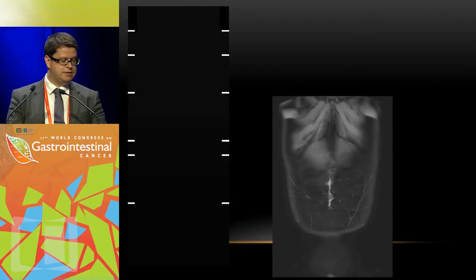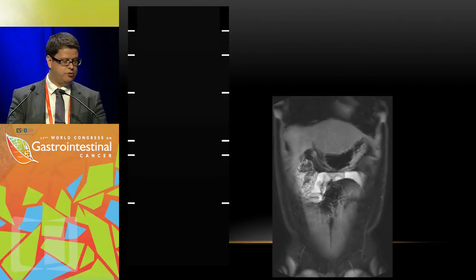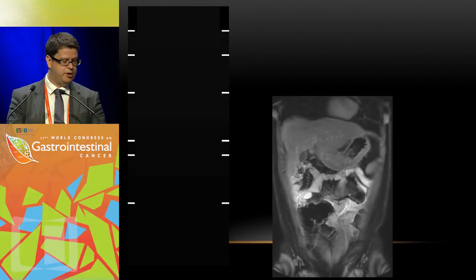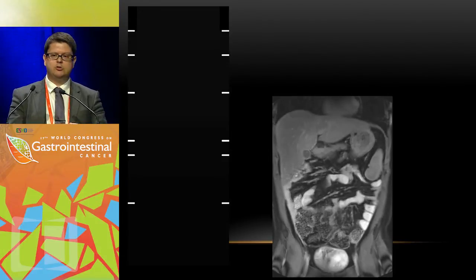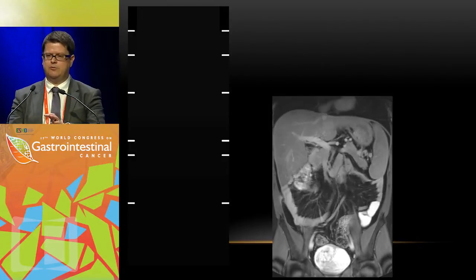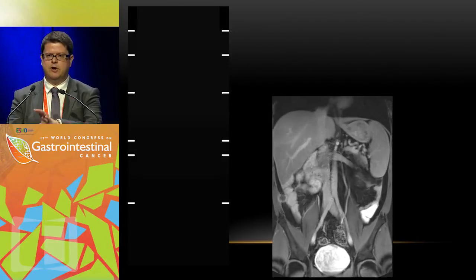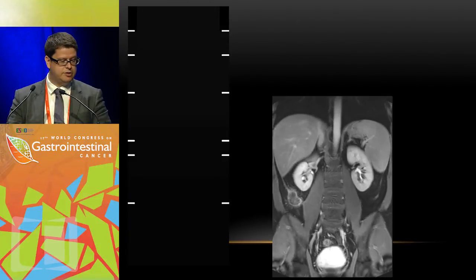Voila. And this you will see especially on the center line, this is important. The one we saw as a bright dot is here between the colon and the small bowel. This very likely does not obviate surgery in this patient, but this is something we have to tell the surgeon: watch out, there is a 5 centimeter deposit on the small bowel and you will probably need a resection.